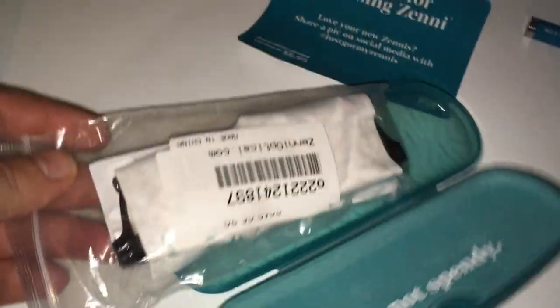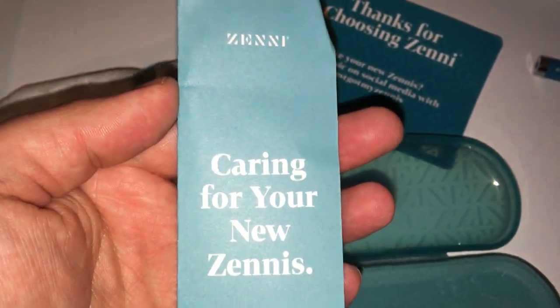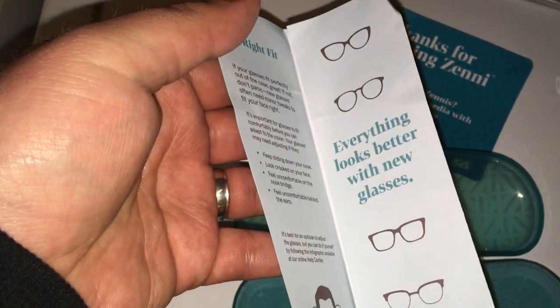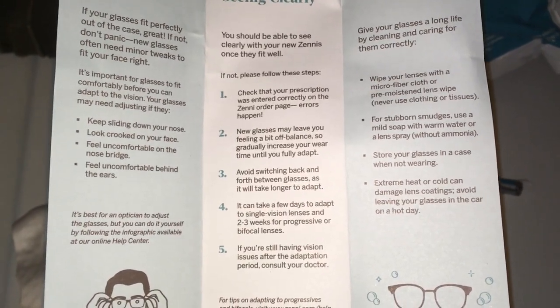Next up, the eyeglasses themselves, which are tucked away in here somewhere. It looks like we have a little pamphlet-type situation about caring for your new glasses — help center, talk to us, kind of situation. Telling you what to do and all that good stuff. Here is all that goodness if you want to pause and read that.